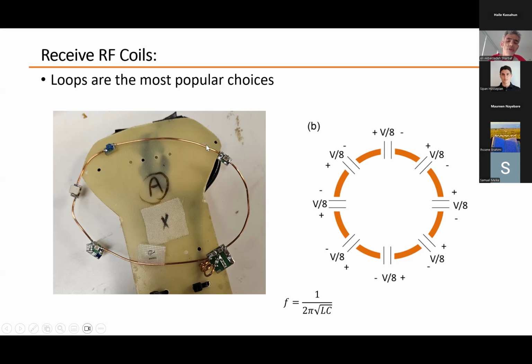Depending on the size of the loop, we insert a different number of capacitors, because we try to keep the length of the wires shorter than a certain length. If the wires between capacitors are too long, the current induced in this simple wire itself can generate unwanted currents that make everything much more challenging.